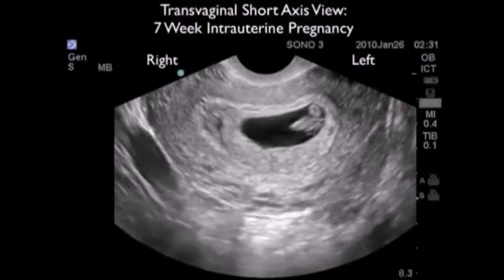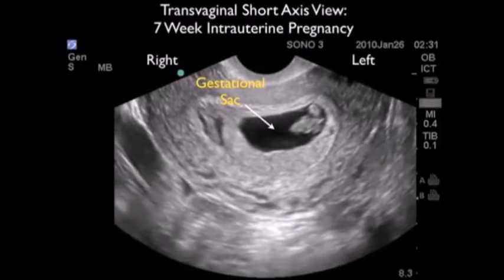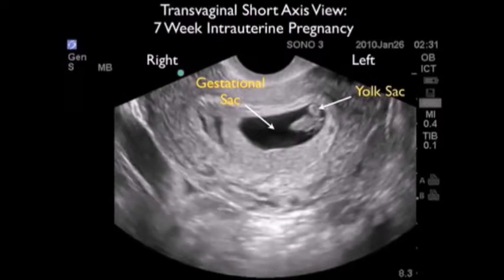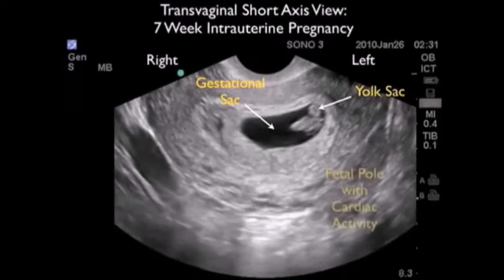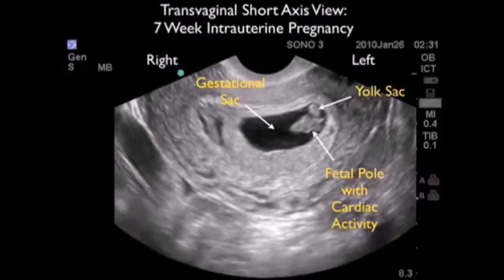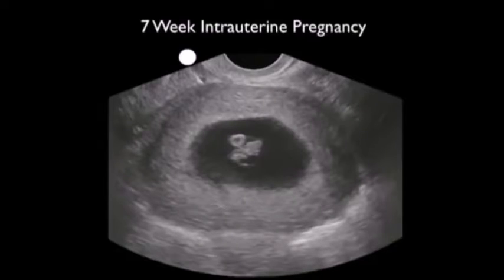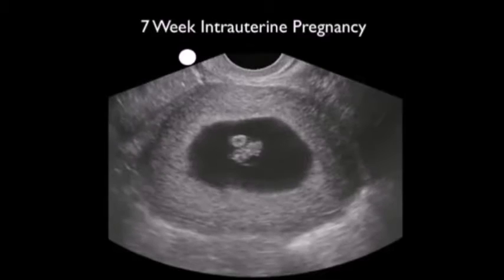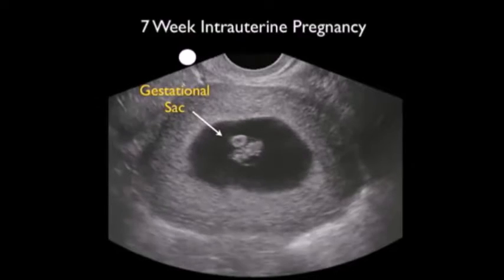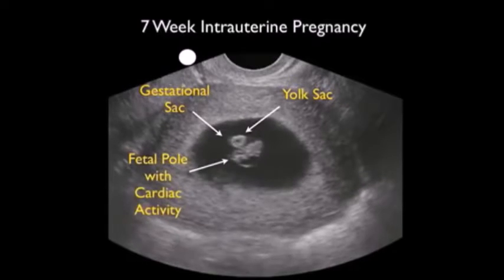Here's a transvaginal short axis view of a 7-week intrauterine pregnancy. The gestational sac is located in the center of the uterus with a good amount of myometrial mantle surrounding it, signifying a fundal location. We see the positive cheerio sign or yolk sac to the upper right aspect of the gestational sac, and right below it the fetal pole stretched out. Notice the positive cardiac activity as we scan back and forth through the fetal pole. In another 7-week example in short axis, we again note a good uterine mantle around the gestational sac, the yolk sac or cheerio sign, and the fetal pole stretched out below it with positive cardiac activity.